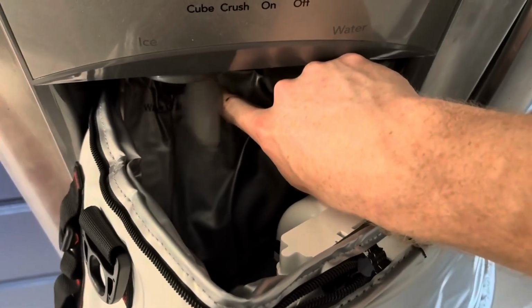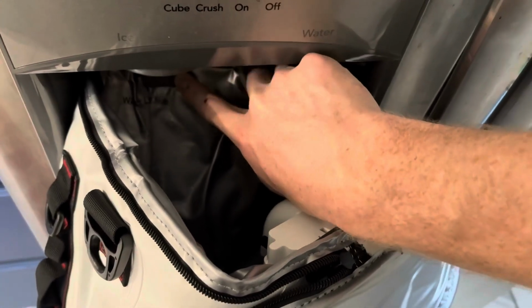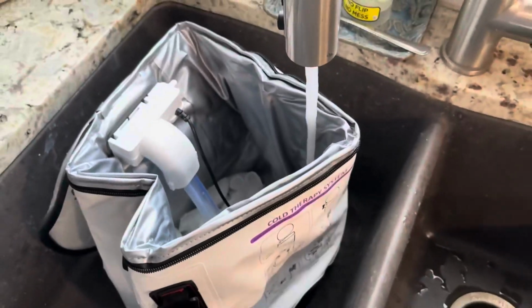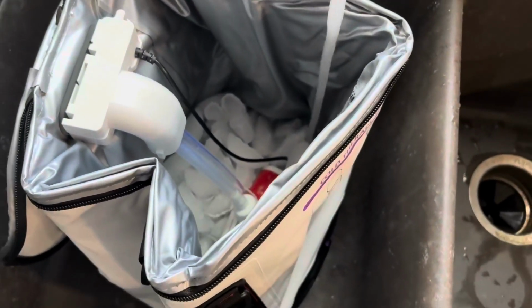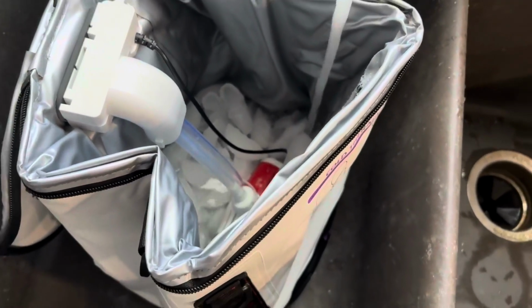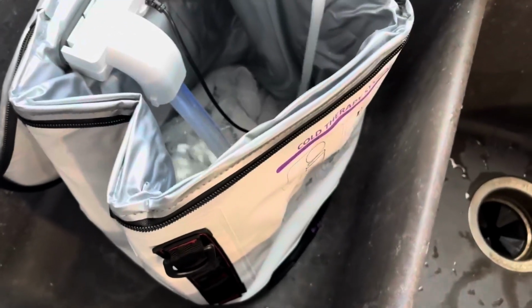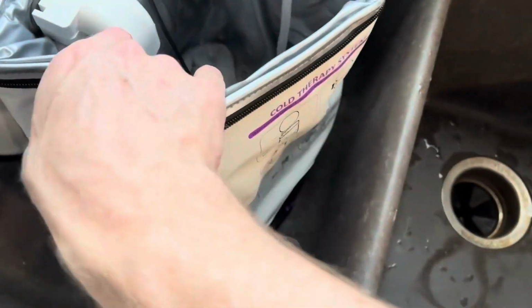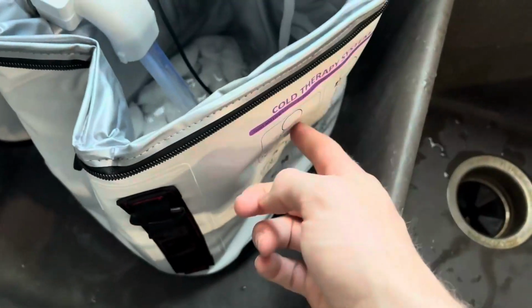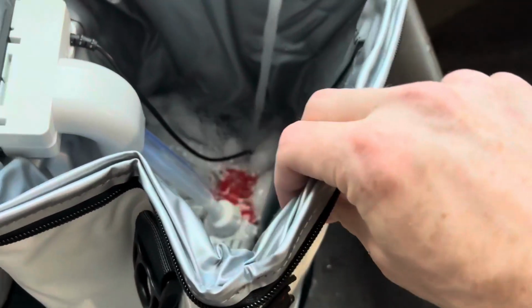Guys, now I'm filling up this thing with some ice. Didn't get it all the way full, but I think I got it most of the way. And then I'm going to fill it up with some cold water, about halfway, and we're going to go for it. I think the colder you want it, the colder you can get it, but at the same time, make sure it's full of water so that there's enough to go through the pump and into the pad. So fill this thing up as cold as you like it, and just make sure it's full enough to keep circulating for a while.